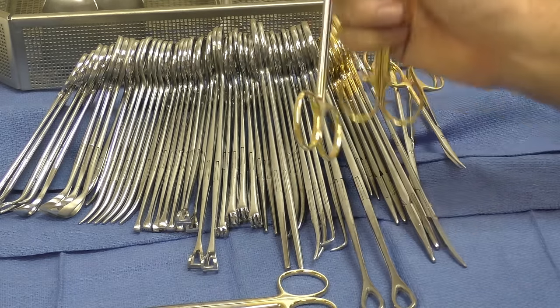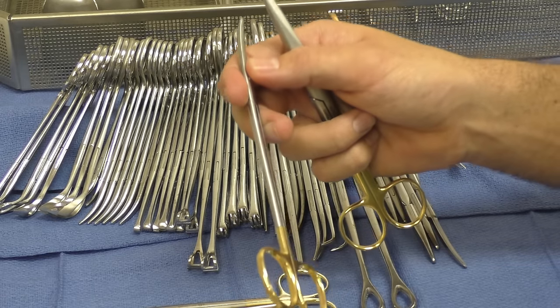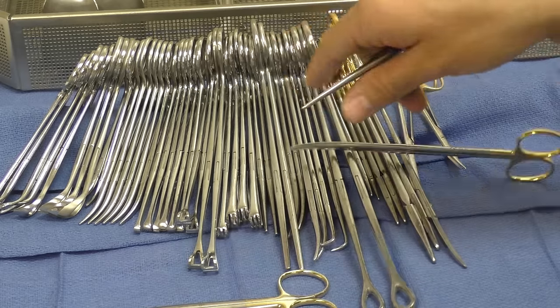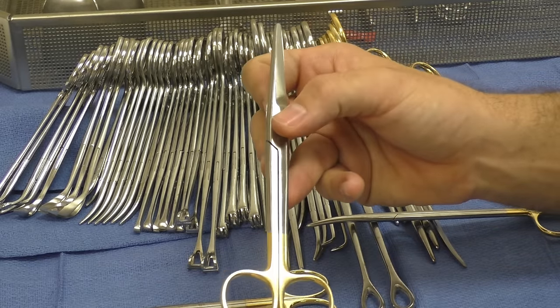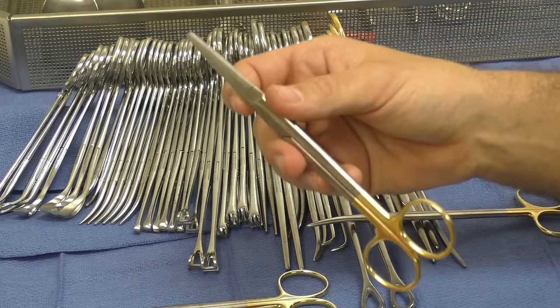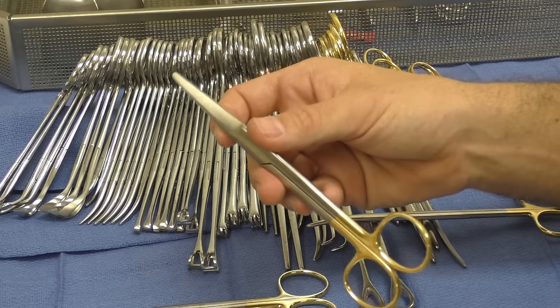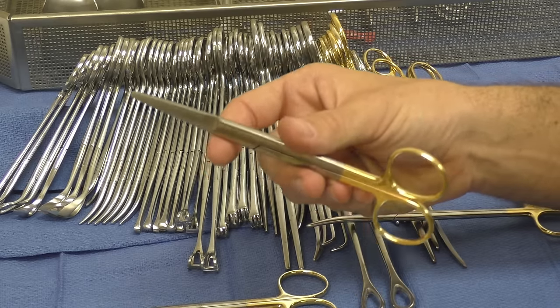If you give the surgeon the Metz scissors to cut suture, he's probably gonna say, please give me the suture scissors. So if they're asking for a suture scissor, it'll most likely be this Mayo scissor. Not all surgeons are the same, but 99% of the surgeons I work with in general use this as a suture scissor.